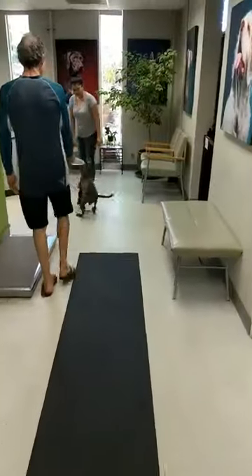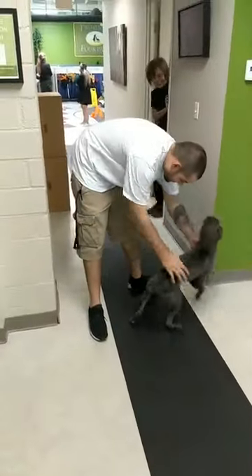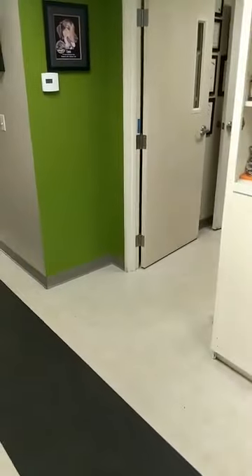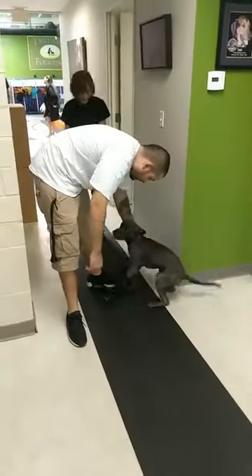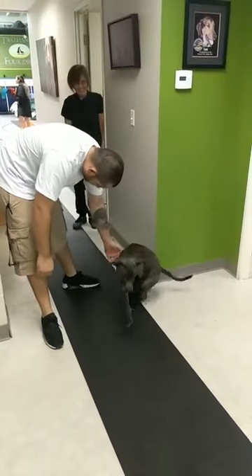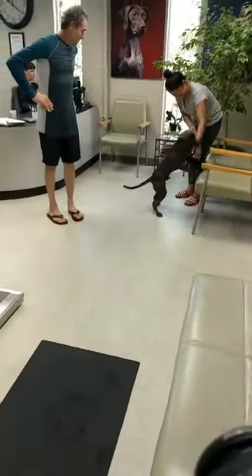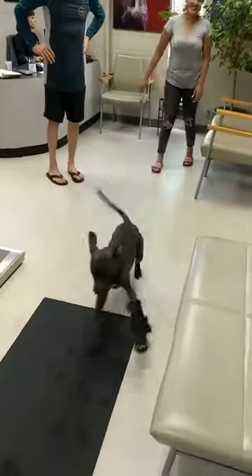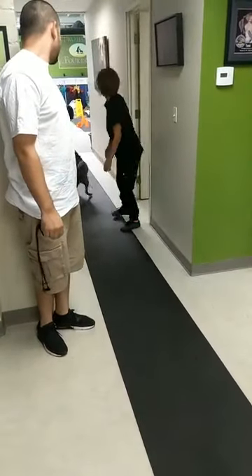Oh man, it's so much better. When he puts it down — look at him. He's so rambunctious!